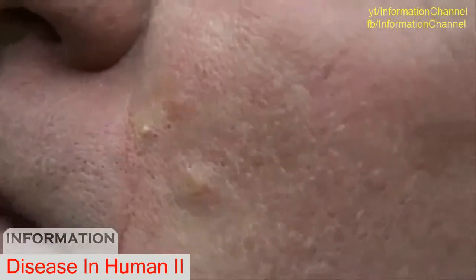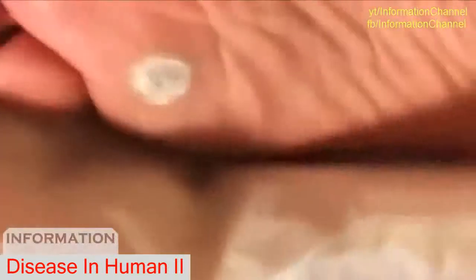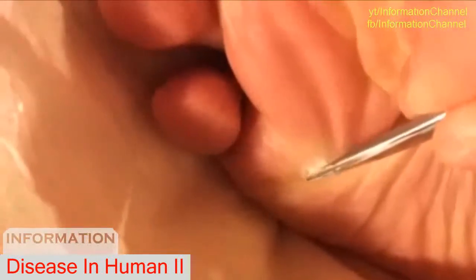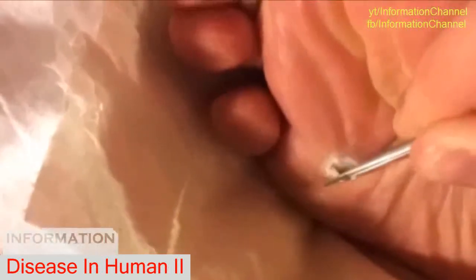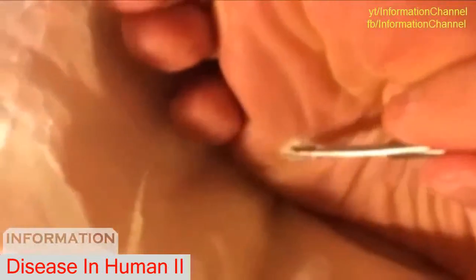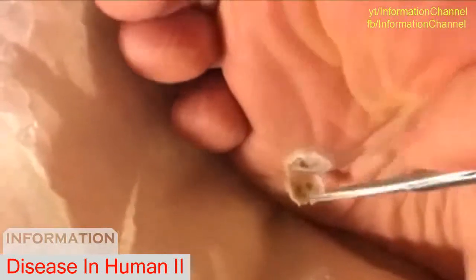Now, do you feel anything there? Yes, I do. That does hurt? I need to get you some more anesthetic there. It wasn't real bad. Let's get a hold of it. Here we are. What a mess.